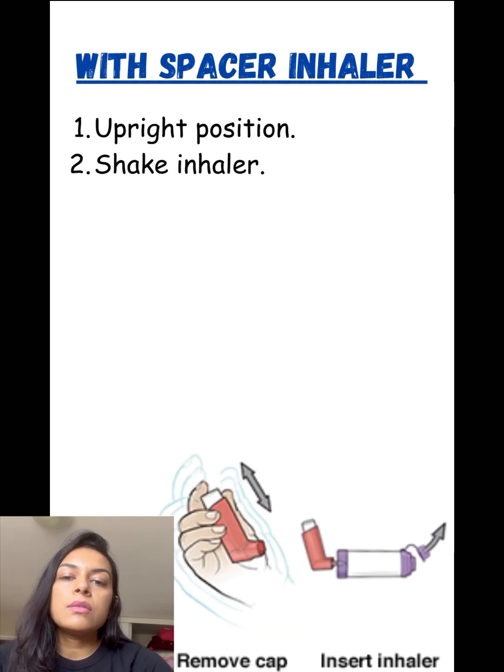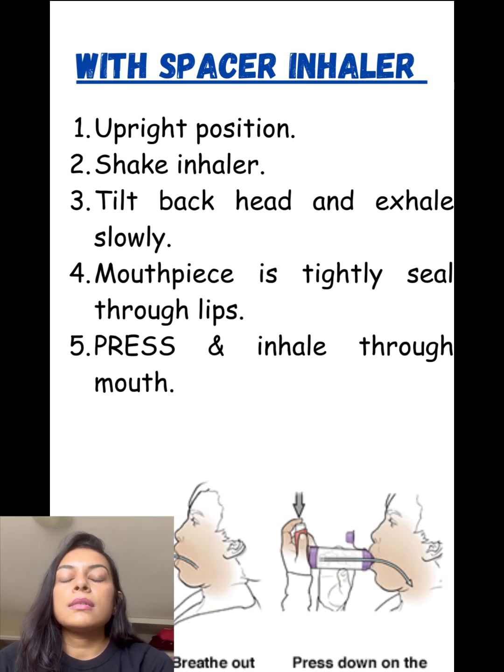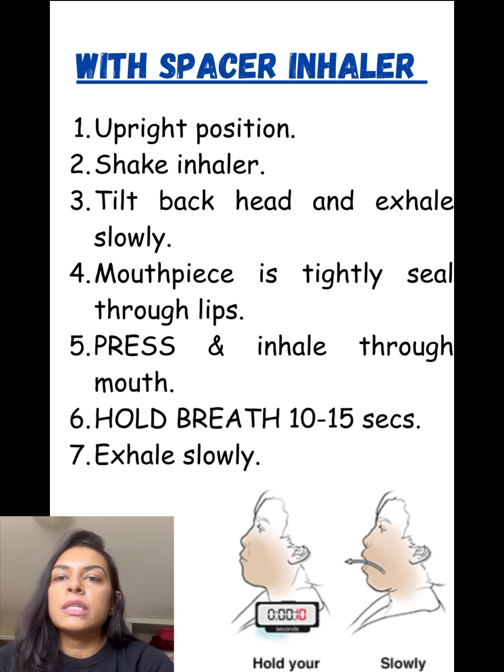And with the spacer inhaler, the same position: we put the client in an upright position, shake the inhaler, attach the inhaler to the spacer, and ask the client to tilt back the head and exhale slowly. The mouthpiece is tightly sealed with the lips in this inhaler. We press it, the client inhales through the mouth, holds the breath for 10 to 15 seconds, and exhales slowly.